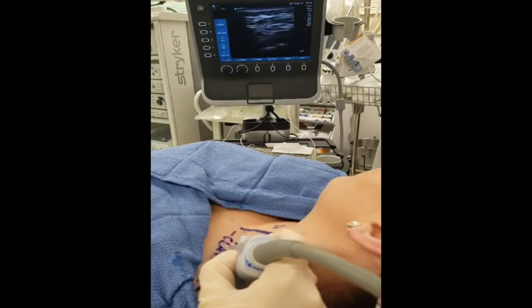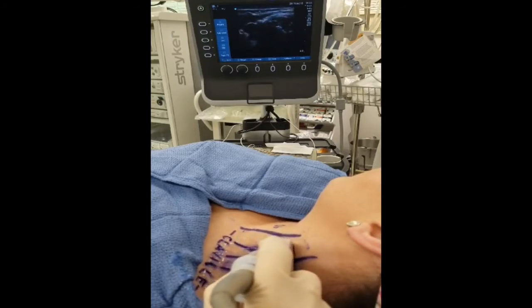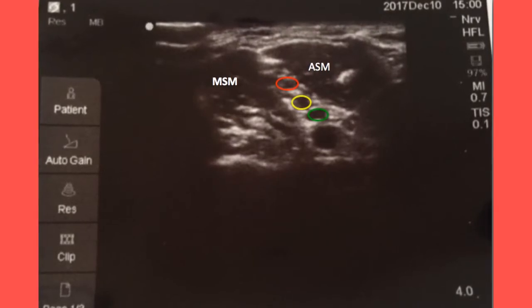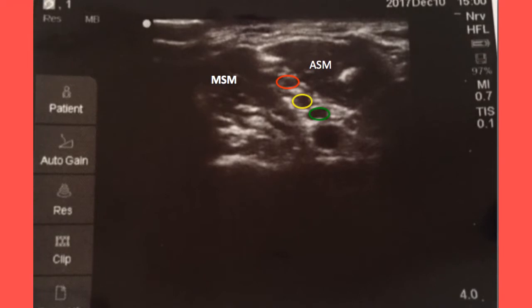If using the ultrasound technique, work from the clavicle up until you find the three roots of the brachial plexus, which will resemble a stoplight. Remember to use a probe cover. The roots of the brachial plexus will be located in between the anterior and middle scalene muscles.